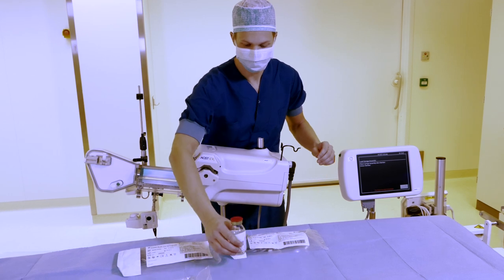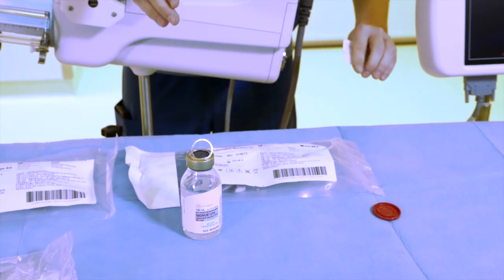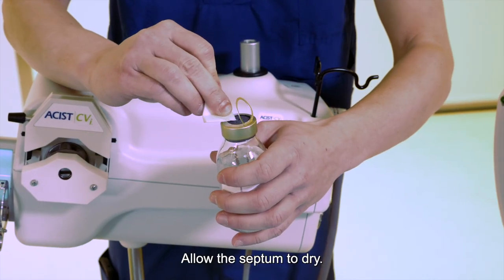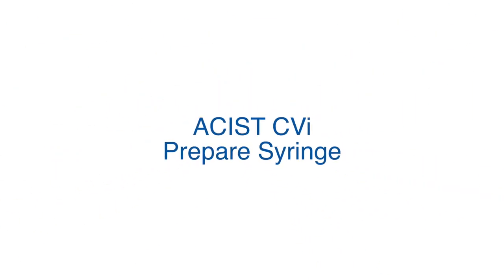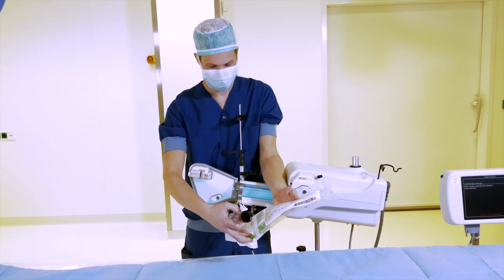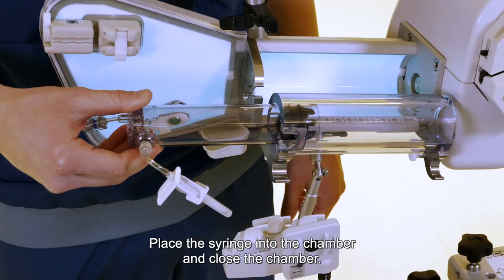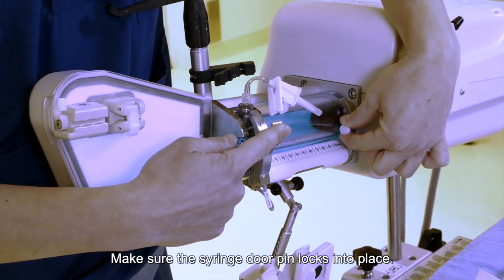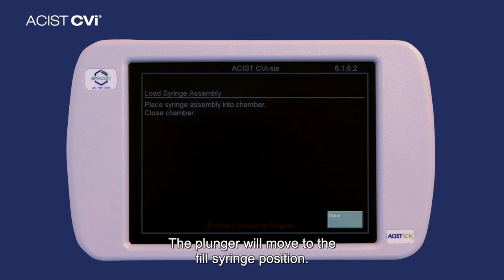Prepare the contrast bottle. Use a pre-packaged 70% IPA wipe to wipe the contrast septum. Allow the septum to dry. Open the syringe kit and remove all the end caps one at a time. Place the syringe into the chamber and close the chamber. Make sure the syringe door pin locks into place. Press Done. The plunger will move to the fill syringe position.